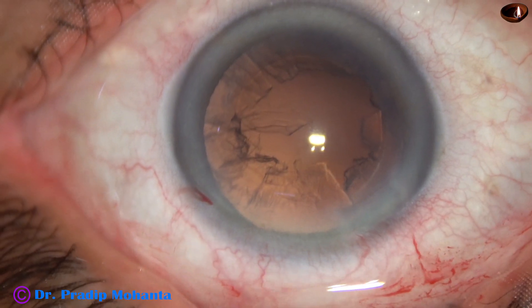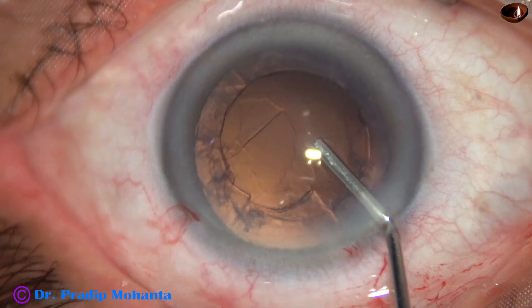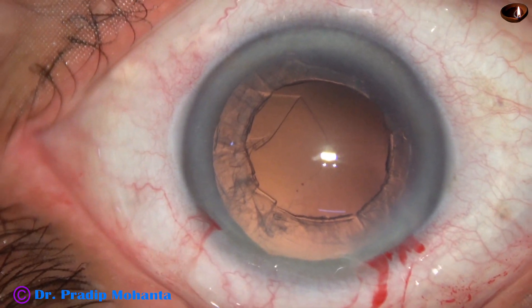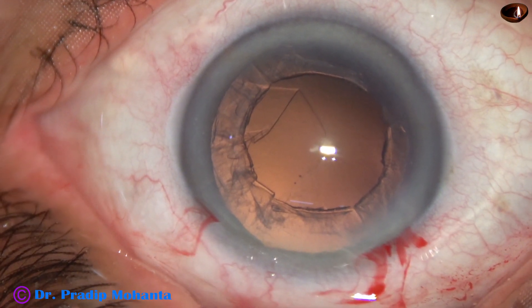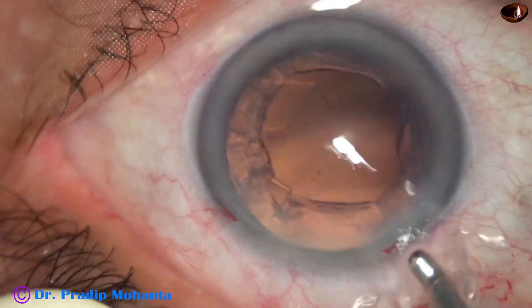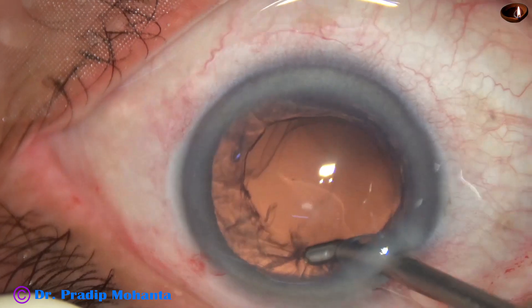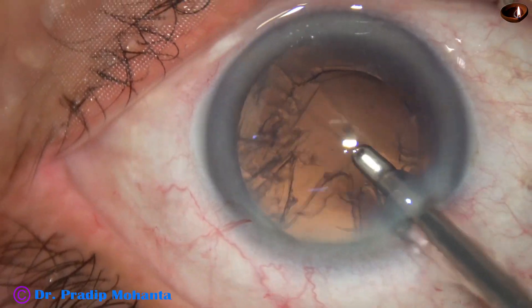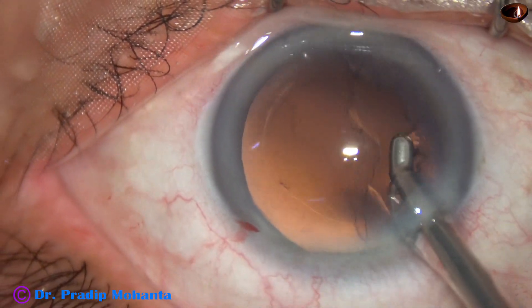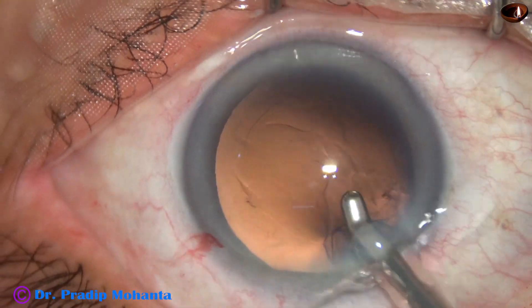And now some more visco. You can see the rhexis nicely after injecting visco in this case. This is a coaxial irrigation aspiration system, also from Oatly. The machine used is from Oatly. The pre-chopper is designed by Dr. Sohail Irfan Khan of Maharashtra, India.